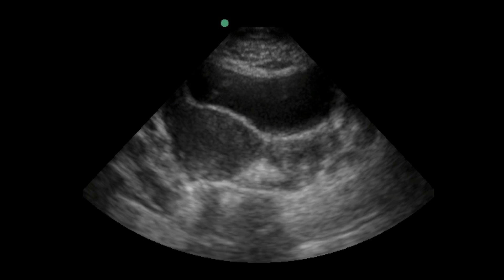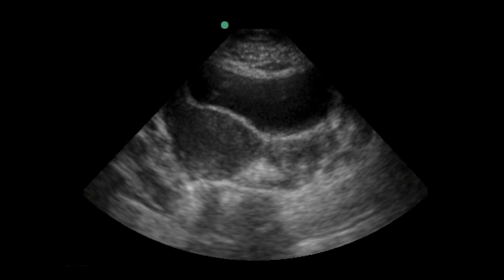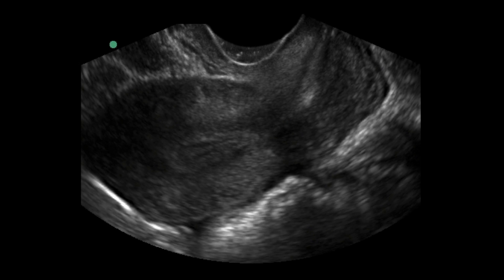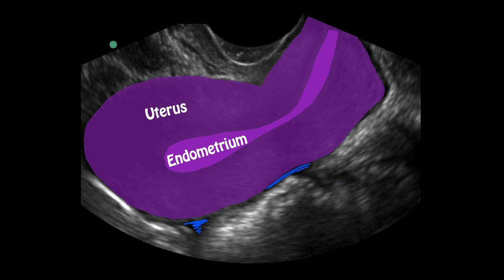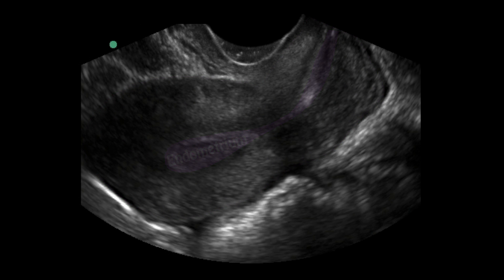Have the patient urinate to empty their bladder, then introduce the transvaginal probe into the vagina with the probe marker towards the ceiling — the patient will be in the supine position. We'll get the uterus with the endometrial stripe right down the middle. The endometrial stripe is typically a hypo- to hyperechoic structure within the uterus that helps us look for where the pregnancy should be. We can also see a small trace amount of free fluid in the female pelvis. If it does not extend more than a third of the posterior wall of the uterus, it's typically physiologic.